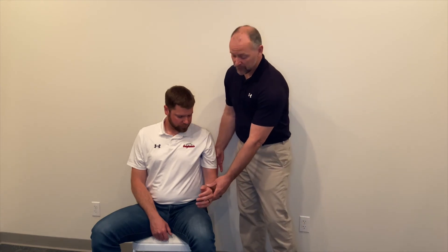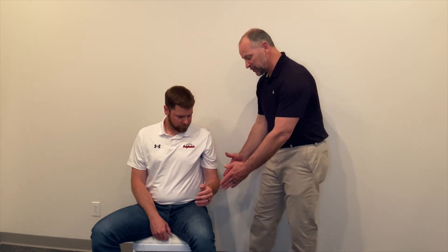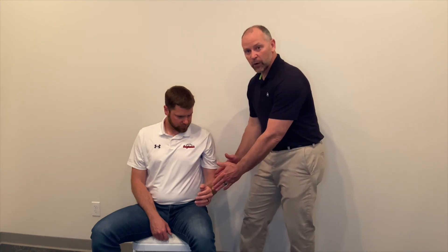The final takeaway point to help assure accurate measurements is positioning the arm as close to 90 degrees of elbow flexion as possible. That helps to identify the lower arm segment and the upper arm segment. We accept measurements in both centimeters and inches; if measuring in inches, always measure to the nearest quarter inch. If you have any questions about these instructions or about other JAS measurements required, refer to our JAS measurement guide or contact us directly here at JAS.